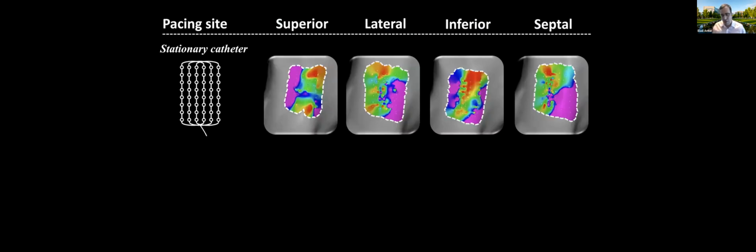But you also have to be careful that a lot of this is not in the service of understanding more physiology or ablating more, but in the interest of marketing and hype. One example would be omnipolar mapping with a grid catheter. I think it's a good idea. Omnipolar mapping means that, instead of just making bipolar electrograms along a spline, M1 and M2 if it's an ablation catheter, or the electrodes along a single spline if it's a pentarray, because you have a fixed grid here, you can make electrograms not only along, but also across.